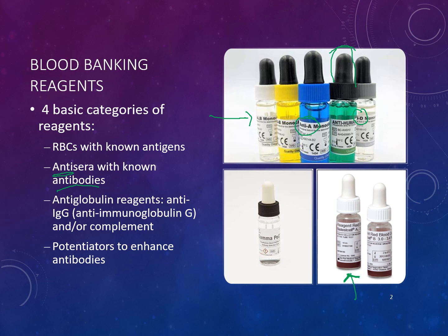We learned in immunology that certain antibodies, like IgG type antibodies, may have weaker expressions. So sometimes in the blood bank world, we need something to enhance that. Here we have an example of an enhancement type of reagent.